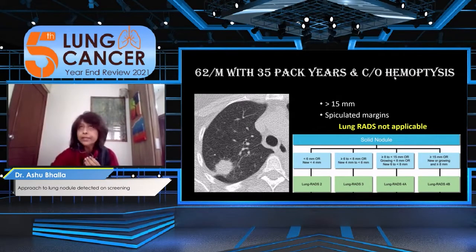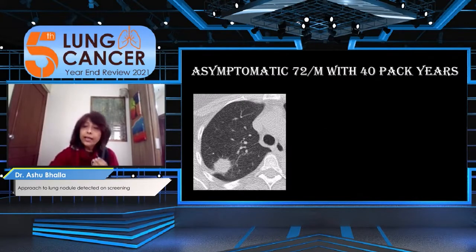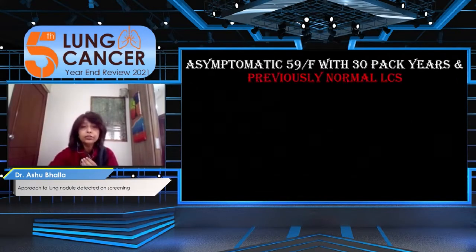Patient already has hemoptysis. So you should have looked for carcinoma lung in this patient anyway. So it's not a screening exam. But the same thing, if you were doing it in an asymptomatic patient with say 40 pack years and it was a part of a screening exam, then yes, this would go into a 4X category. So that's the difference to be understood.